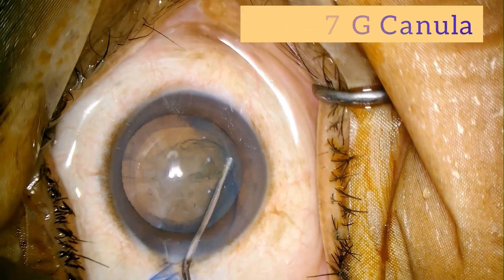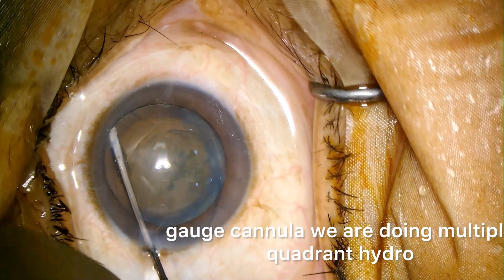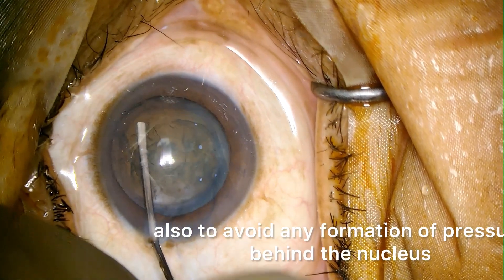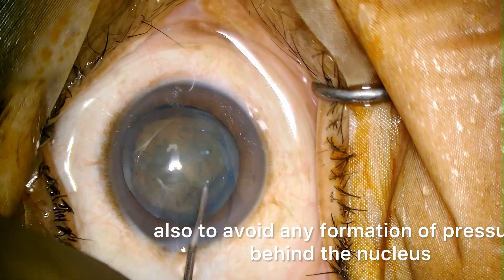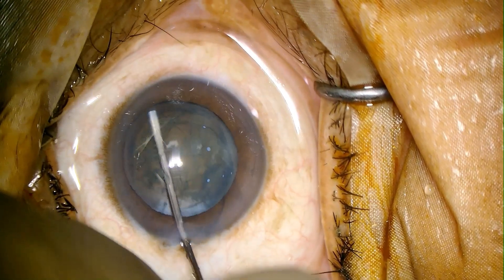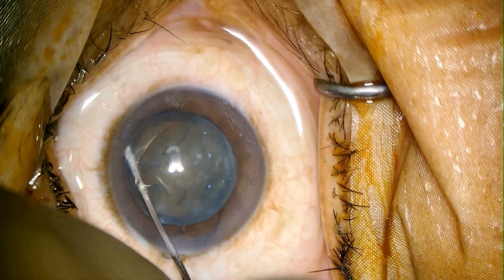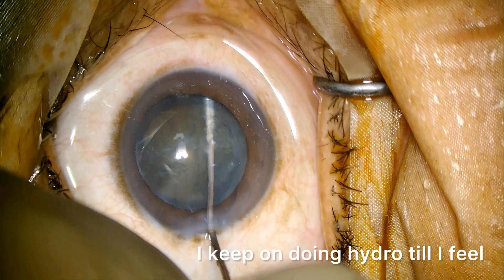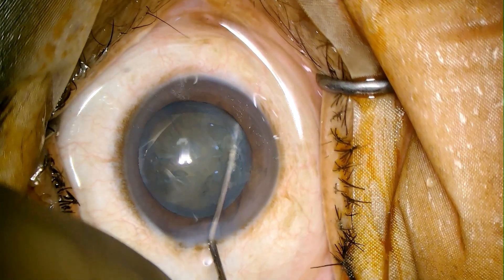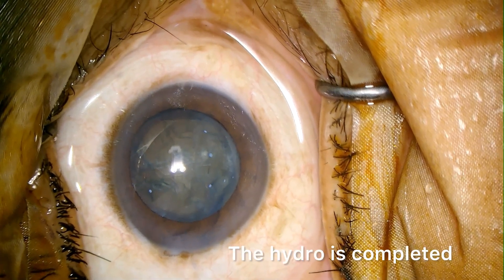With a 27-gauge cannula we are doing multiple quadrant hydro, and in between we are decompressing the nucleus also to avoid any formation of pressure behind the nucleus. I keep on doing hydro till I feel that the nucleus is free from all 360 degrees. The hydro is completed.